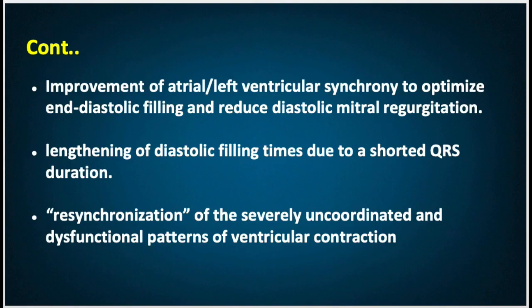The demonstration of long-term benefits from biventricular pacing would serve a growing population of patients who have heart failure and potentially a broad scope of patients who have left ventricular dysfunction and require antibradycardia ventricular pacing. Biventricular pacing will likely expand in use in patients with chronic atrial fibrillation, particularly those who require AV junction ablation for either heart rate control or treatment of symptoms.